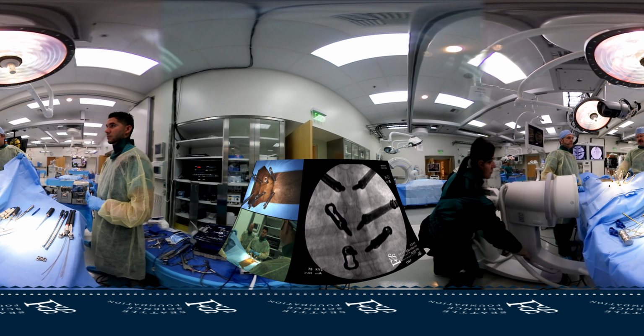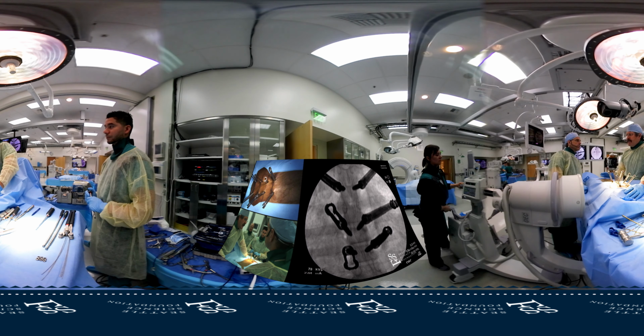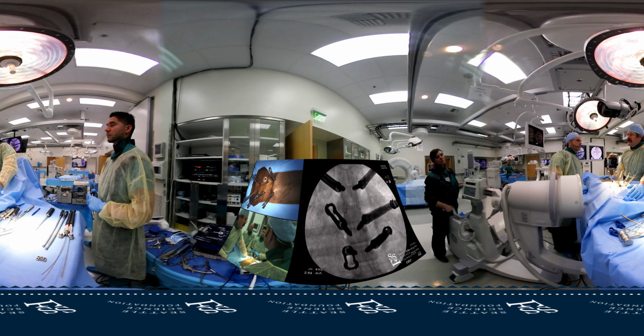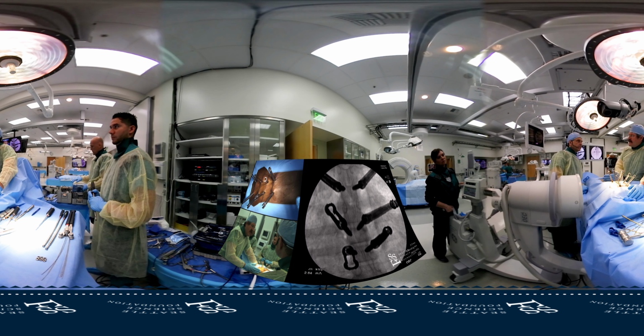Here's the problem I have with screw stimulation, is it's very sensitive. And I've seen people that do it. I had a partner that always did it, and he was always taking out screws and changing them. And every time we run a screw in and out of a pedicle, we lose some strength to that screw. And if we do it twice, we probably ought not to even bother putting it in. And he was doing it all the time. I would look at his thing, and I would say, why'd you leave out all those screws? Oh, they stimmed wrong.